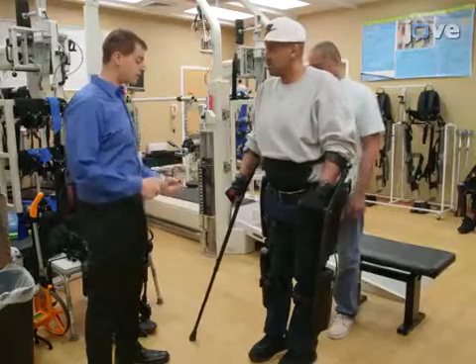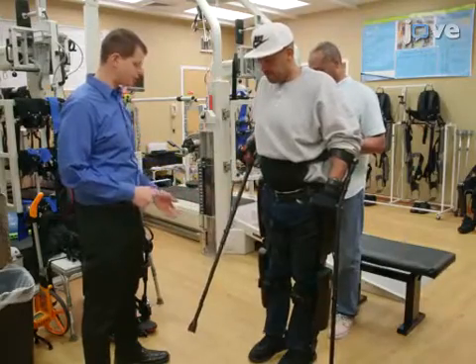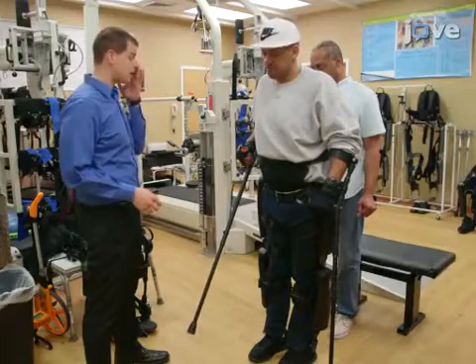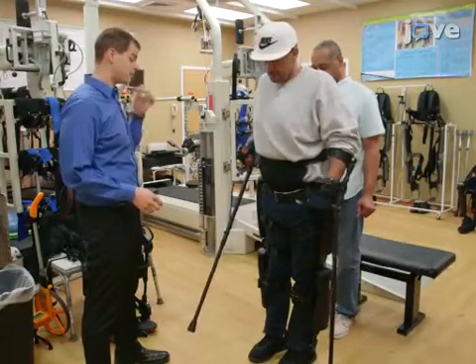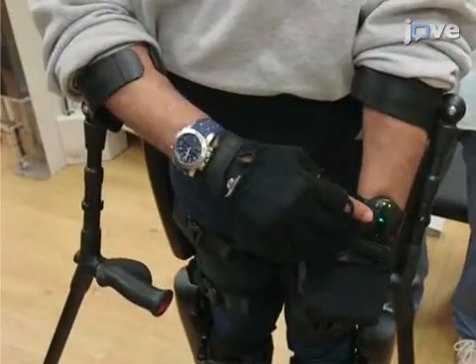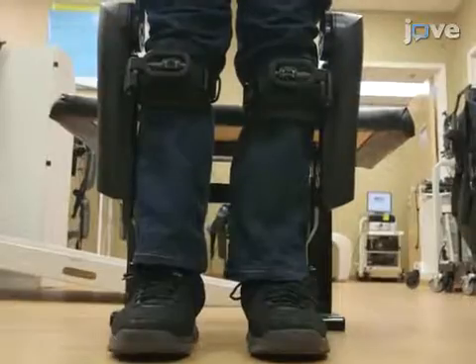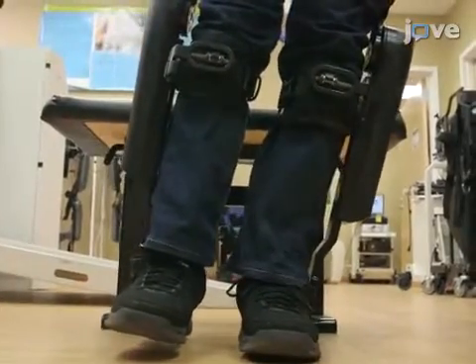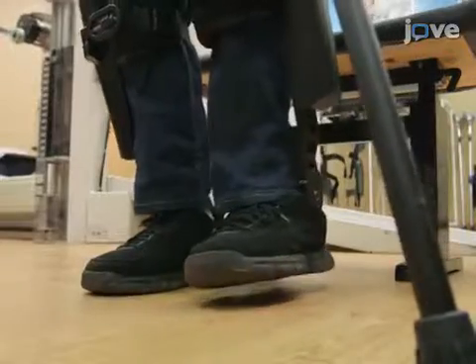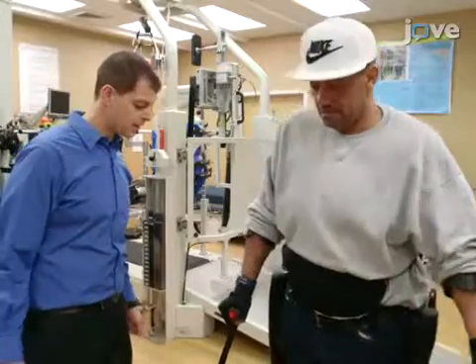Next, instruct the participant to maintain balance with only one crutch by lifting one crutch off the ground and holding that stance up to one minute. Add complexity to this one-handed balance exercise by having one arm balancing while the contralateral arm reaches over to touch the balancing arm's wrist. Finally, teach the participant to weight shift laterally, allowing one foot to offload with the goal of lifting the foot completely off the ground for five seconds. Instruct the user to repeat this exercise with the other leg.